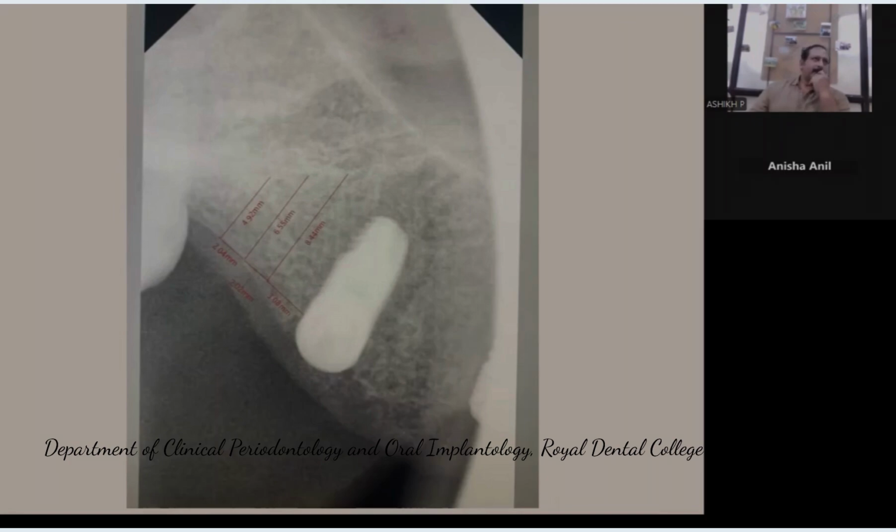expansion. But you cannot go in for a 2 millimeter preparation and then a 4.25 millimeter expansion and all. Go in for the minimum expansion possible, in a very slow manner.